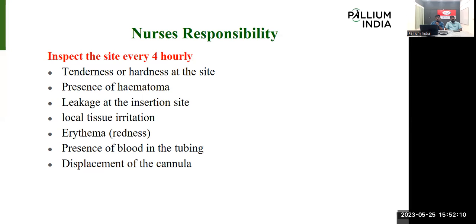So when we fix the external tubing as well, the pulling effect on the inserted needle will not happen, and the displacement will not happen. During work, walking, or daily living activities, if an accidental pull displaces the SV set from the site, we don't reinsert it; we need to put another SV set in the subcutaneous space.